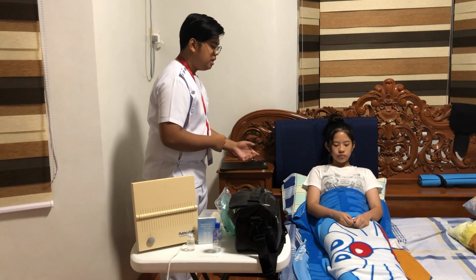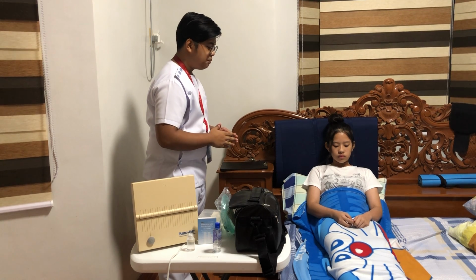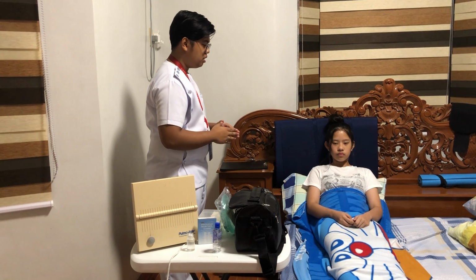And after doing so, we need to confirm the patient's identity using at least 2 patient identifiers according to the facility policy. So, good day ma'am. My name is Marius Miguel Vismonte, and I will be your nurse for today. May I ask you po, what is your name?